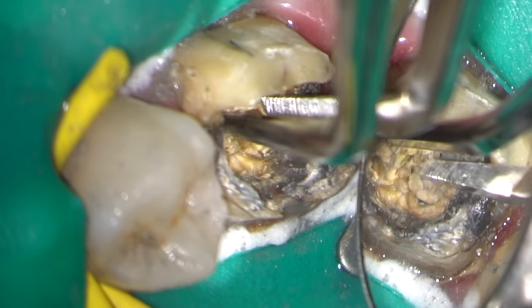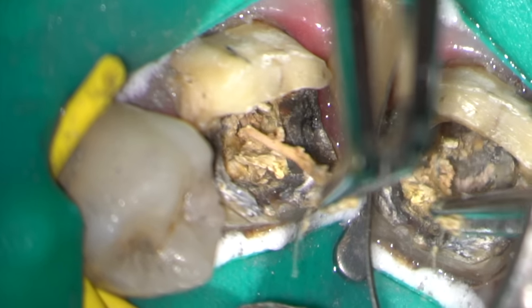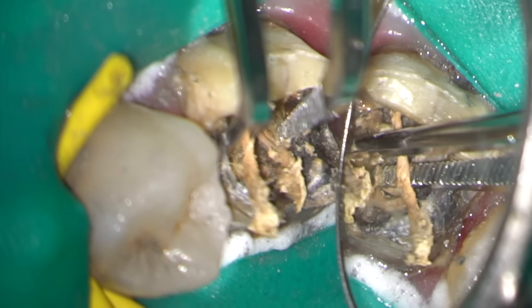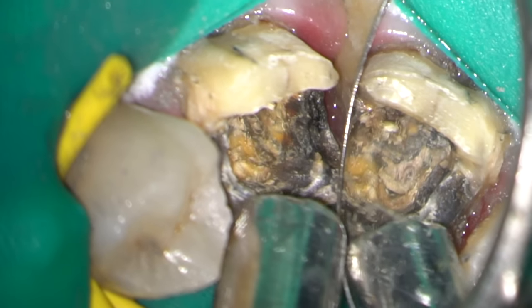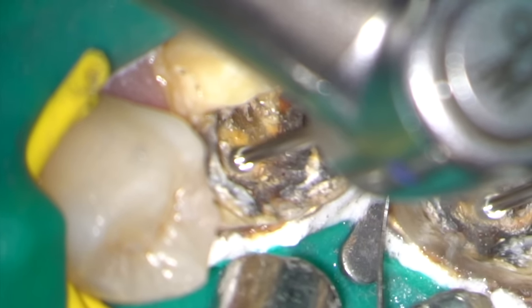You'll notice that I'm using a split dam technique at this point in the treatment, and this is so that I can manage the margins of the tooth distally. Here I'm using an LN burr to just tidy things up. I could equally have used an ultrasonic tip.